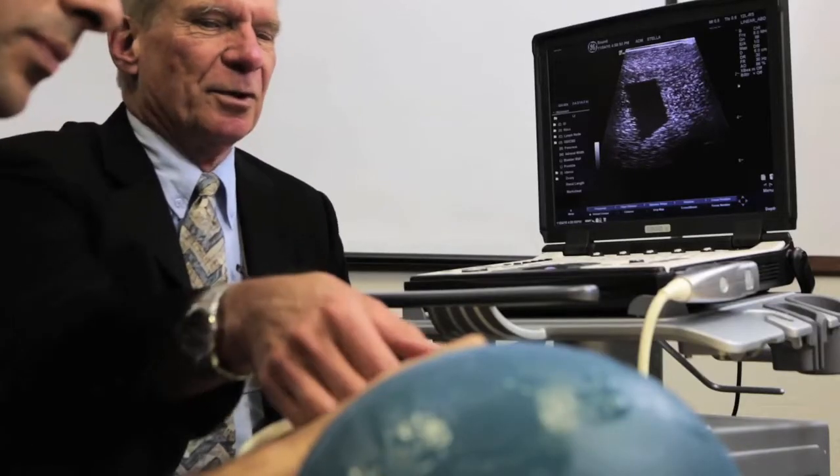You know exactly how that kidney is positioned in three dimensions in that body, and it just makes that task — which is very difficult for beginners often — simple.